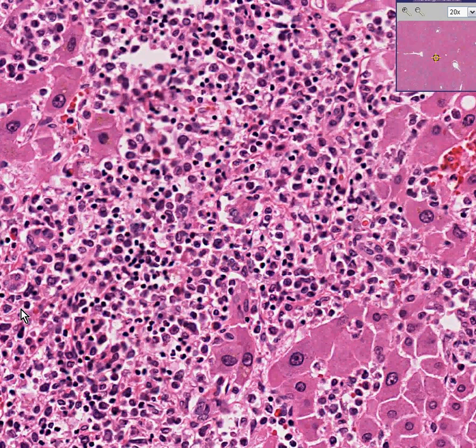The vast majority of cells in this area — although some are true inflammatory cells such as neutrophils or lymphocytes — are blast cells. This is the way a leukemia involves the liver: it's often not portal, but central lobular or sinusoidal.